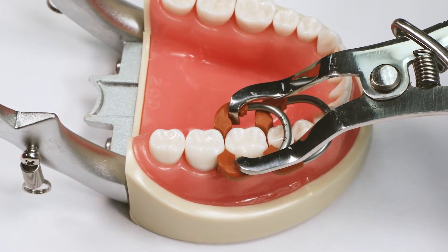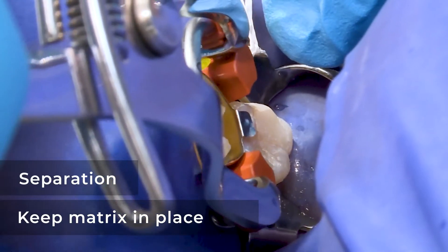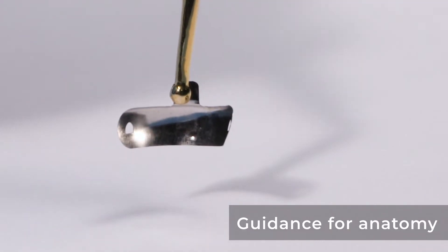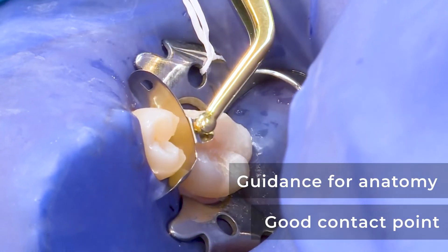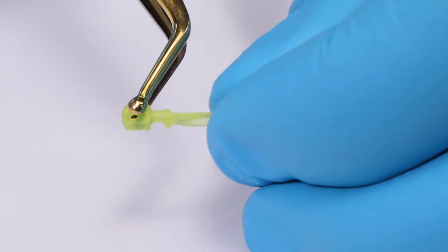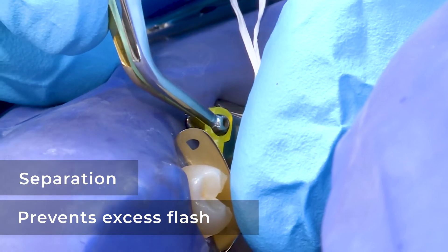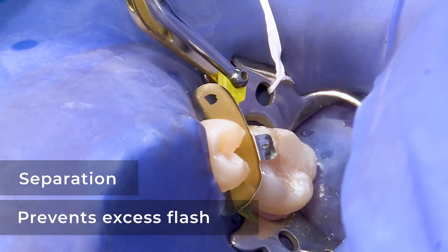The rings are meant to create two things: a separation force and to keep the matrix in position — those two things are fundamental from a ring. The matrix is there to give us guidance, to give us back the anatomy, a good contact point, good adaptation, and everything this means to the restoration. And the wedge is there to provide some separation, but mainly to adapt the matrix into the cervical region, making sure that we don't have any excesses or flashes.